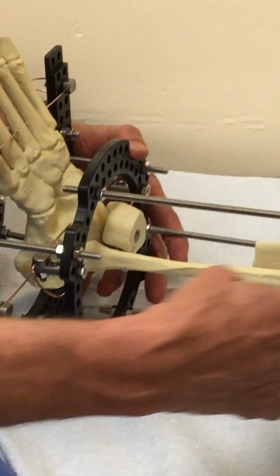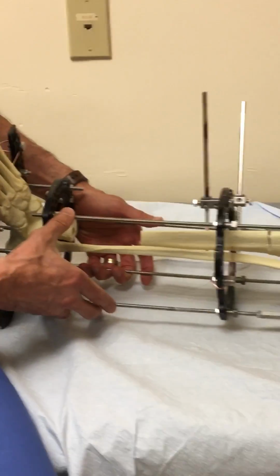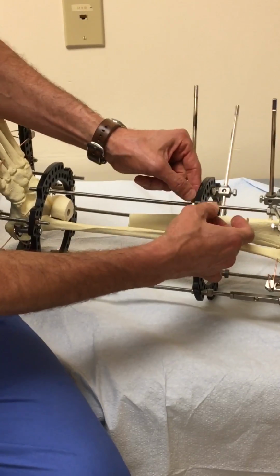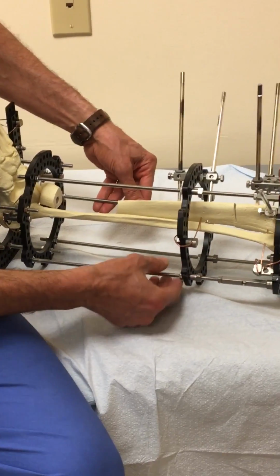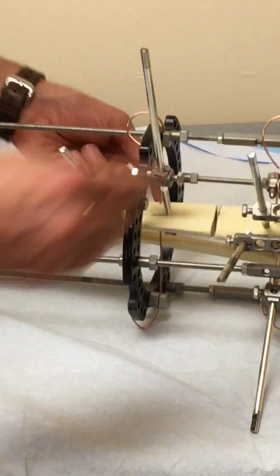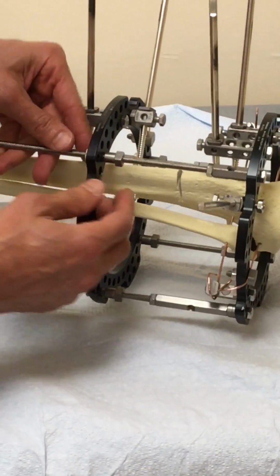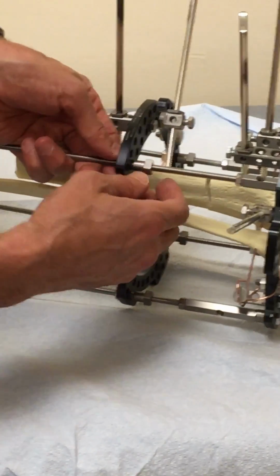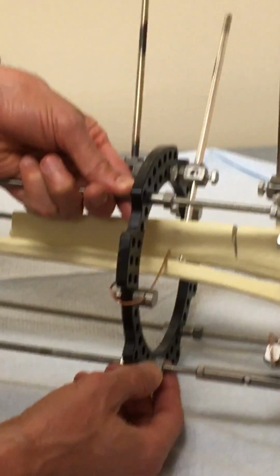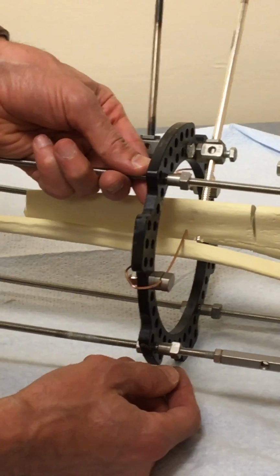Okay. Now, proximally, what we've got is a bone transport frame with 4 long threaded rods. And what's nice about this is we've taken the segment of the tibia out, and I'll leave these nuts loose. And this is how you'll instruct the patient after the osteotomy and after you've waited for about 10 days to start doing the lengthening. Now, I didn't have the clickers, so we put these four-sided nuts, and what you do is you start with the 1 dot facing forward on each one of these, and then you instruct the patient to turn it 1/4 4 times a day.